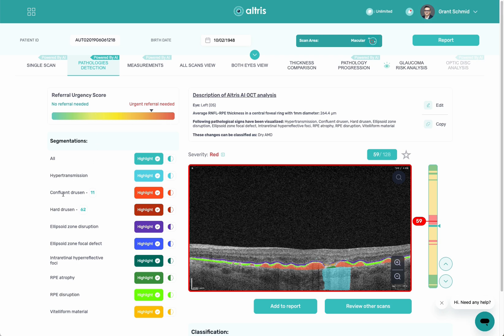You'll see down here all the segmentations that we've identified. We even have a Drusen count right here showing what we've identified. And then over here you're going to get classification. It's really important to understand that Altru's AI does not diagnose — we are a decision support tool. What we're designed to do is give you as much information as possible, but it's still the provider's responsibility to decide if they agree or disagree with what they believe they see.